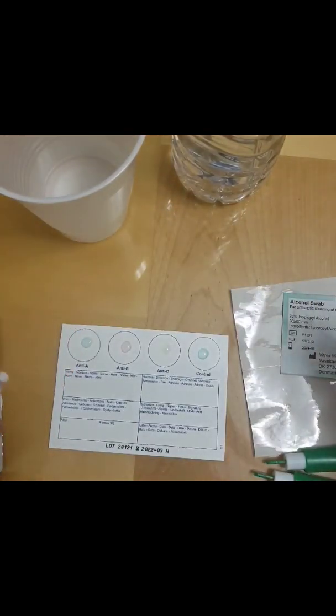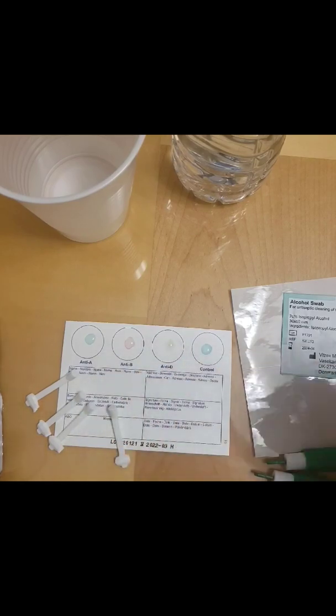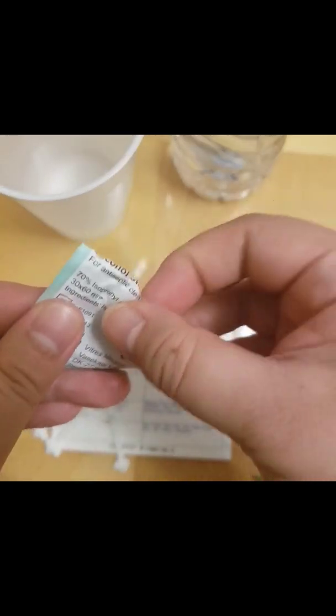Separate the Eldon sticks into four. We're going to be using the Eldon sticks to transfer blood to each circle. Then clean your finger with the alcohol swab.